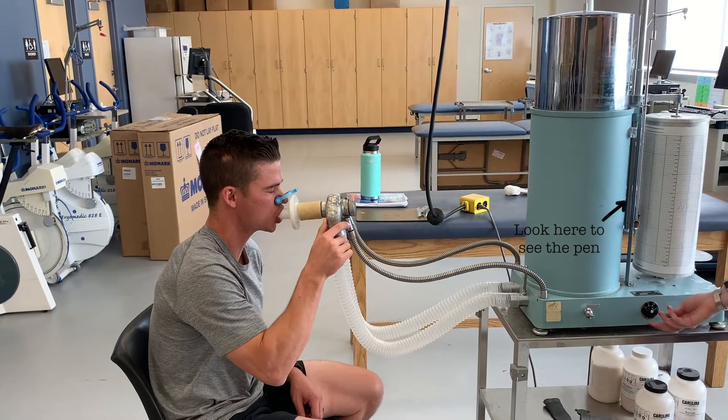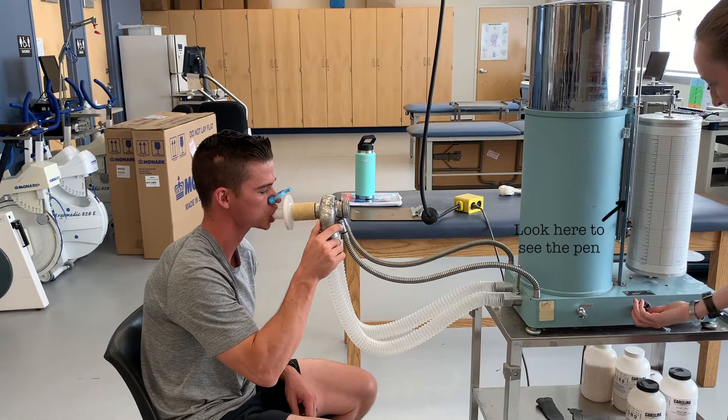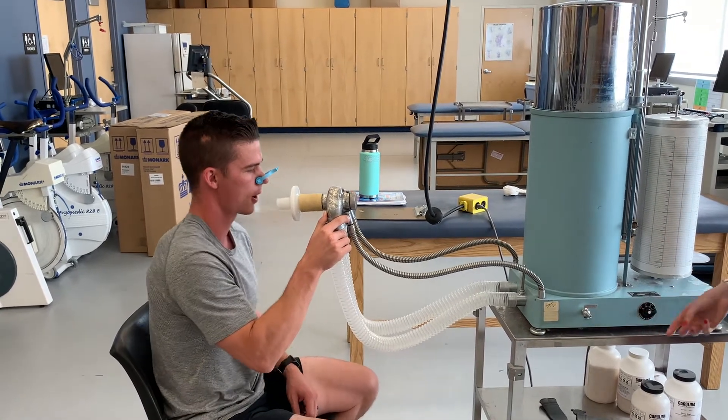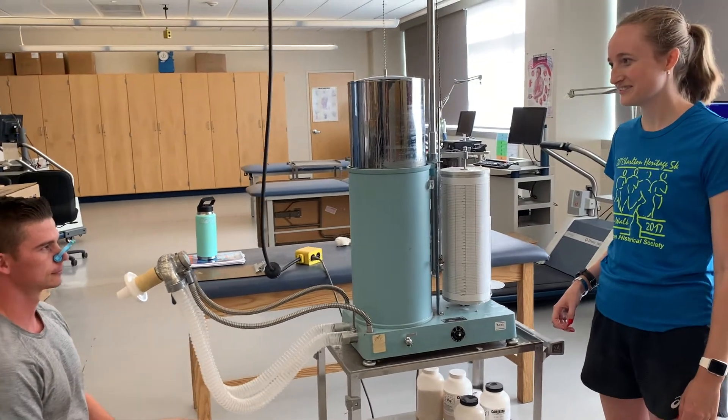Blast it out! Keep going, keep going, push — keep going, hold it, hold it. And you're good, go ahead and stop. Nice job. How was that? Good? I think I could do better.